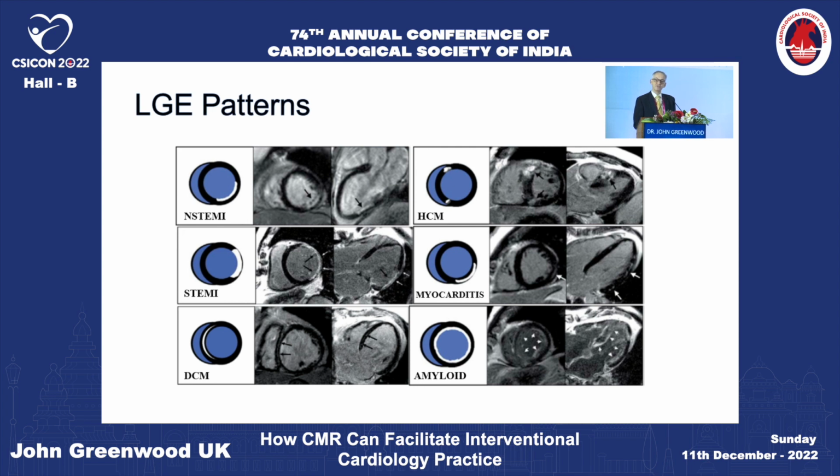So it really does separate out these different disease groups, where they all tend to present the same as an NSTEMI, often with chest pain, funny-looking ECG, elevation in troponin, but it's not always clear what's going on at the time of angiography.